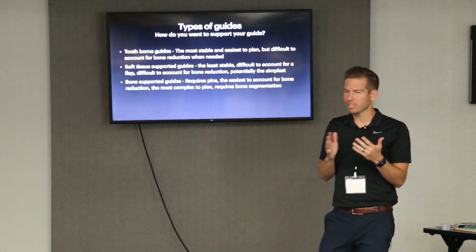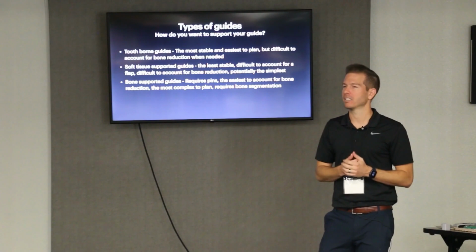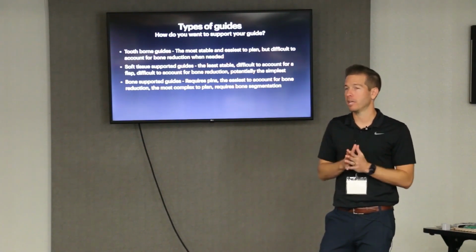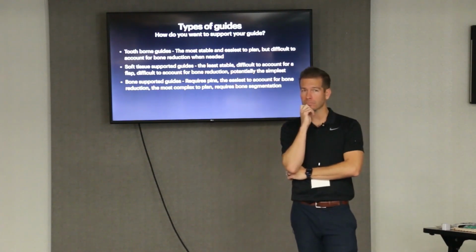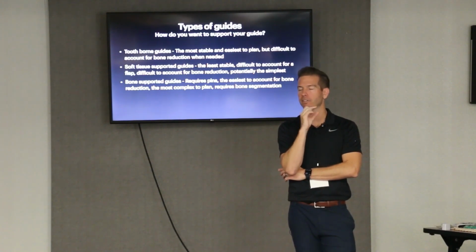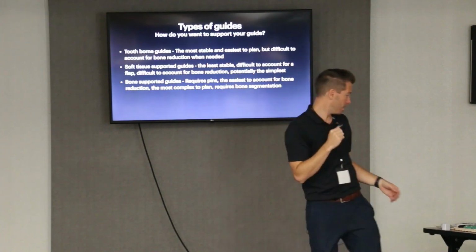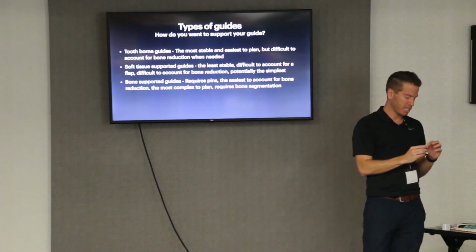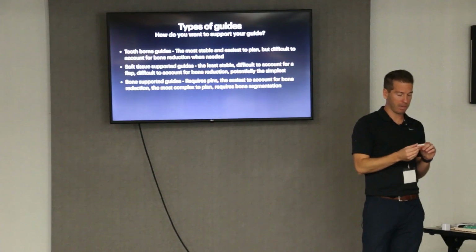It's more complex than that, but not really. It's just taking all the little surgical guide things that we talked about and just doing it. And the other thing is, with Latoya's case, she had some perio, and my restoration isn't even 15 millimeters of thickness. And this is her hybrid. You guys are going to design her case, and you'll see in the back, there's not that much.